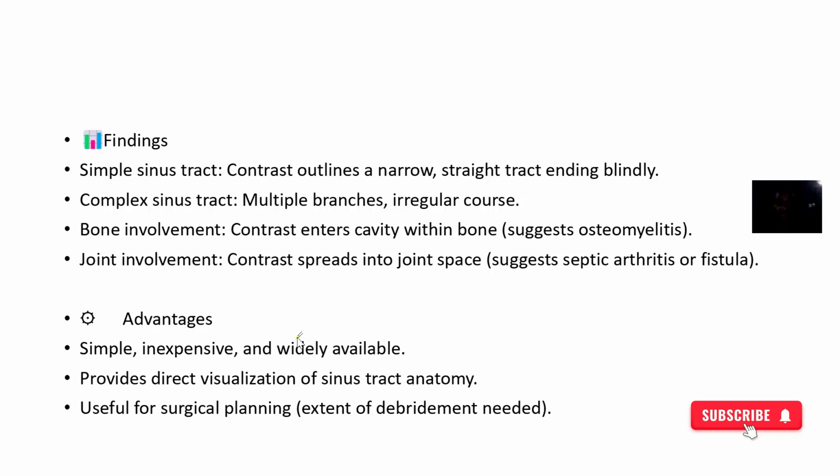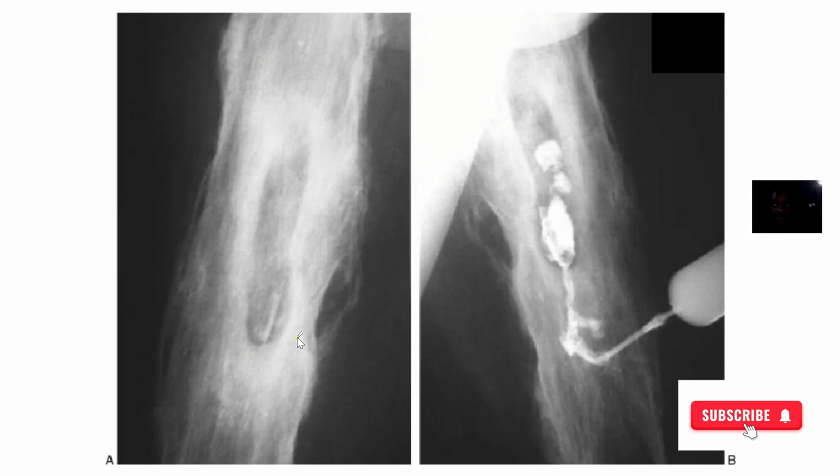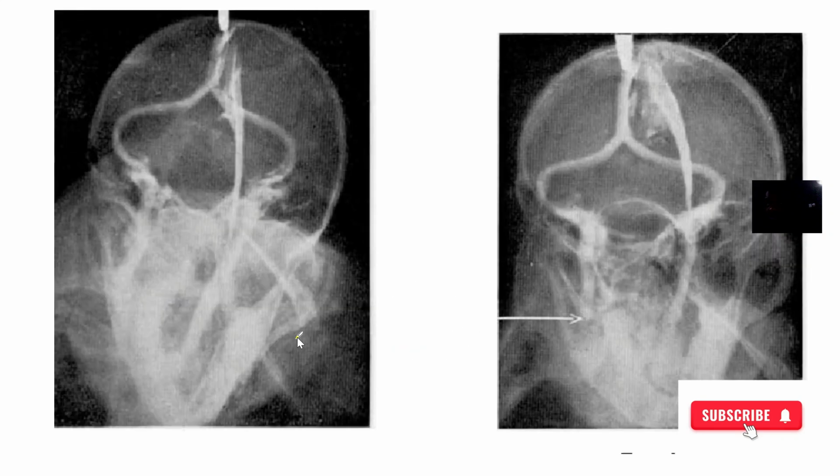You understand? Then the advantages are that it is simple, inexpensive, and widely available. It provides direct visualization for you to track a particular sinus tract back to its source. That is useful for surgery planning. You now know whether a patient needs surgery or whether you can just use drugs in the meantime.